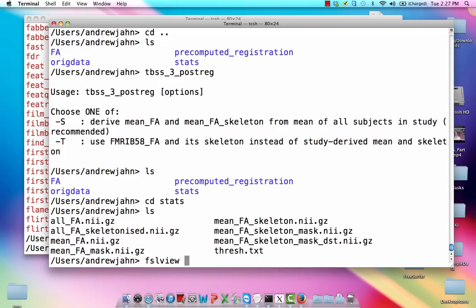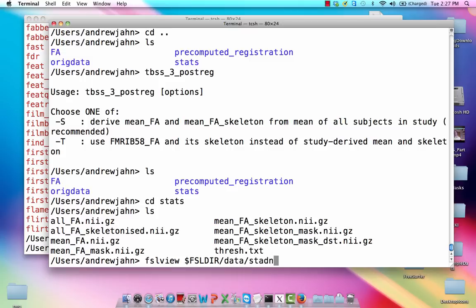So first, what I'm going to do is overlay this skeleton that we just made—sorry, the mean FA map—on top of a standardized template, just to make sure that the registration went okay and nothing went horribly, terribly, horrifically wrong.